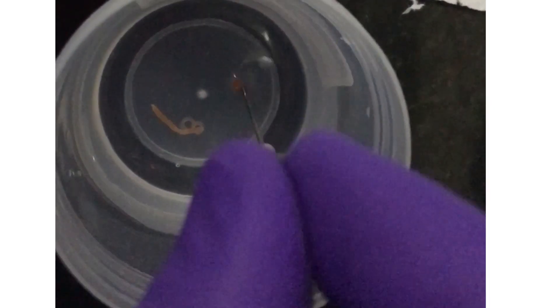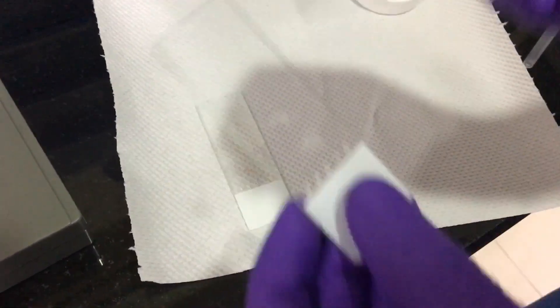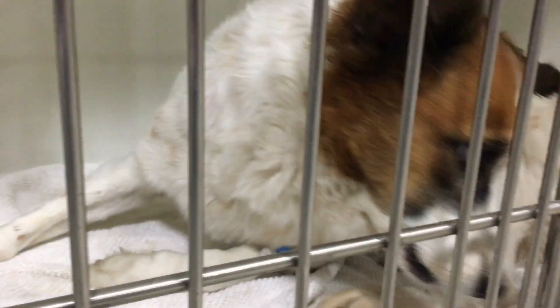This is the size of the tissue taken from the liver. These tissue samples are put in a container filled with 10% formalin. You can also make impression smears from the sample; here I chose to make a crush cytology since the tissue was extremely fragile.